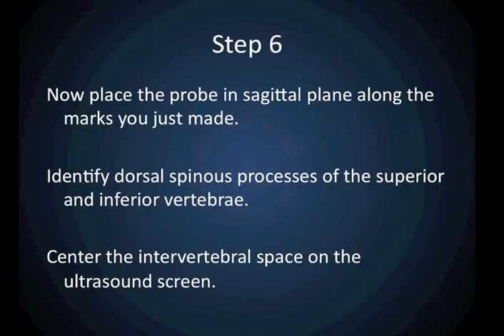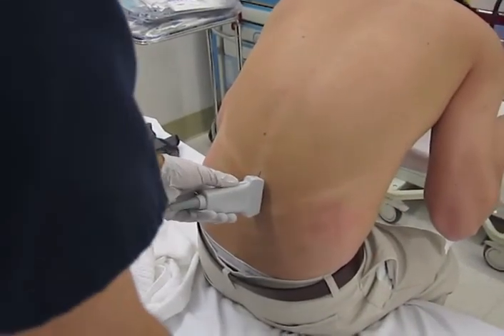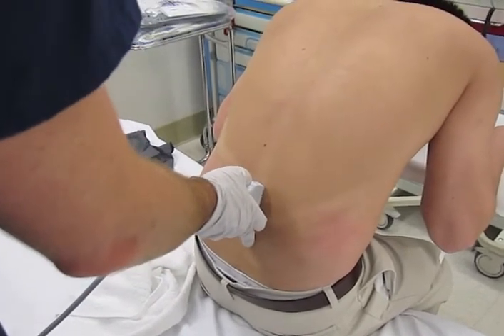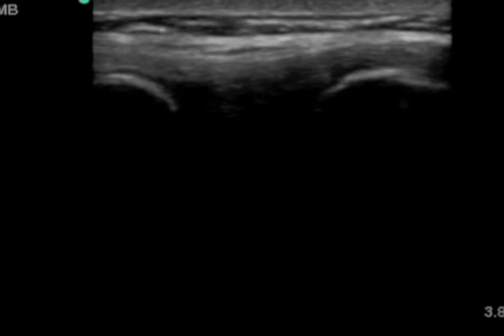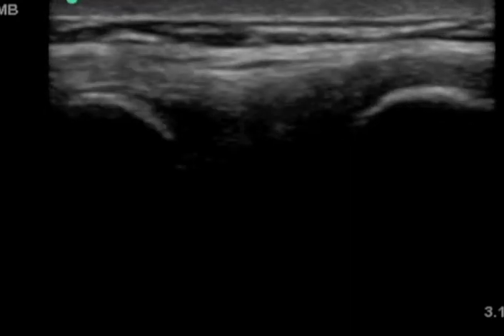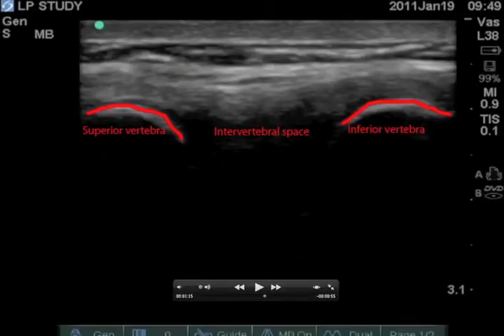Now place the ultrasound probe in the sagittal plane along midline, which is the marks that you just made. Identify the dorsal spinous processes of the superior and inferior vertebra. Now center the intervertebral space in the middle of the ultrasound screen.